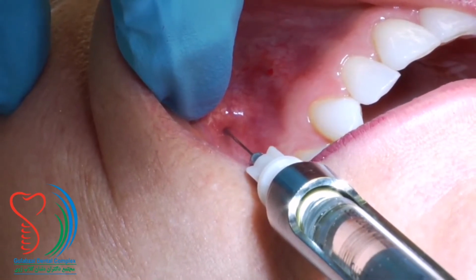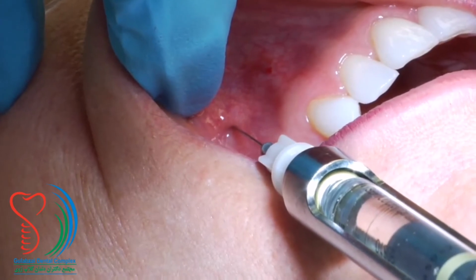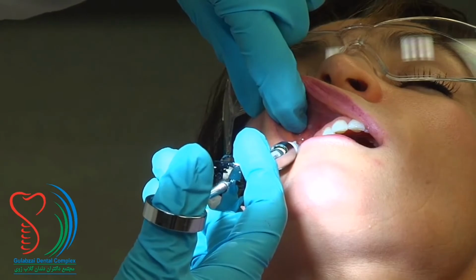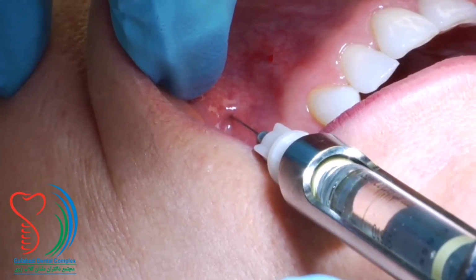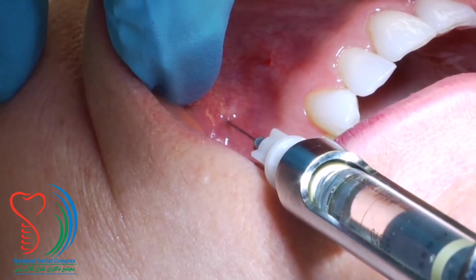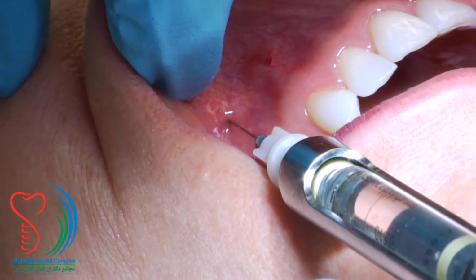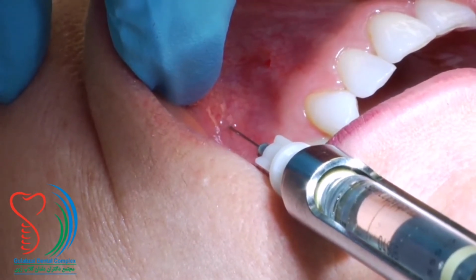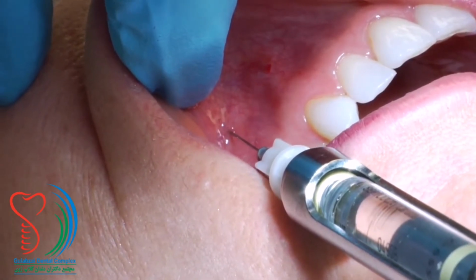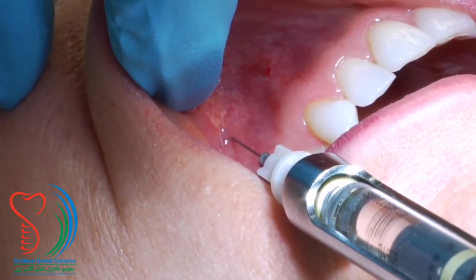To achieve the proper angulation, keep the syringe parallel to the long axis of the tooth, following the contour of the maxilla. Your deposition site is well above the apex of the premolars. The needle probably will penetrate from 1/4 to 1/2 inch into the tissue. When you've reached maximum depth after a negative aspiration, deposit approximately 1/2 cartridge of anesthetic with multiple aspirations.